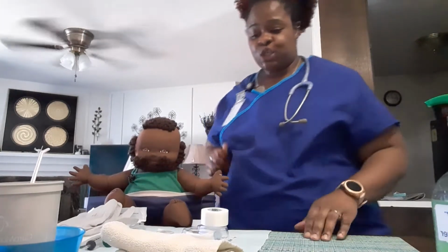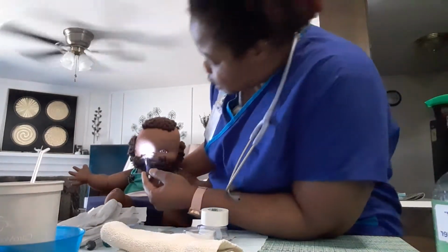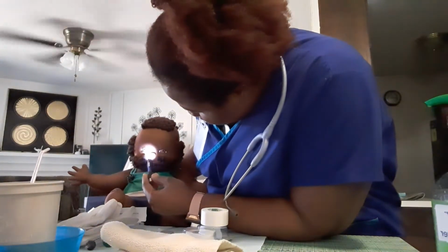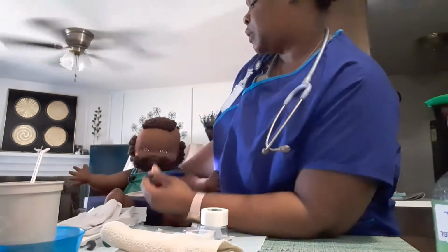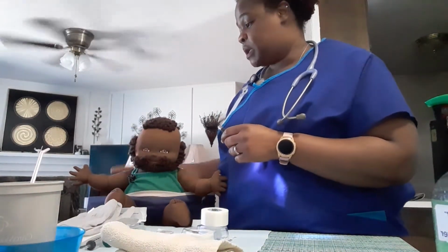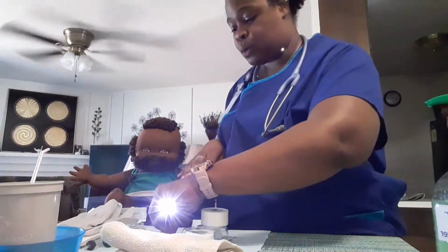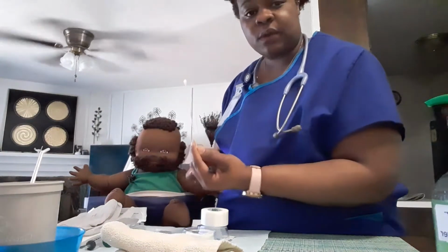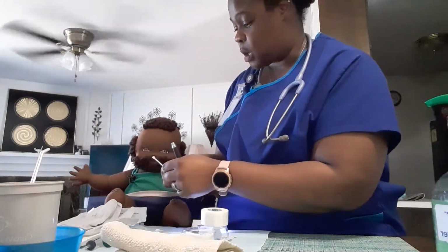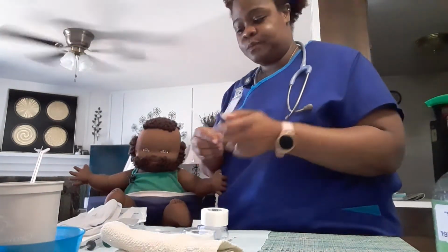Next, I am going to get a pen light. I'm going to look in the patient's nose. I'm looking for any nasal polyps, bleeding, irritation to the mucosa, any obstructions, and a deviated septum. I'm going to ask the patient if he has a recent history of nosebleeds, nasal trauma, or any nasal surgery, and he said no. Next, I will assess the gag reflex with a wooden Q-tip. I'm going to check gag reflex is present.